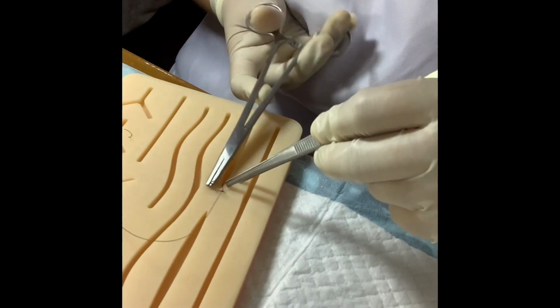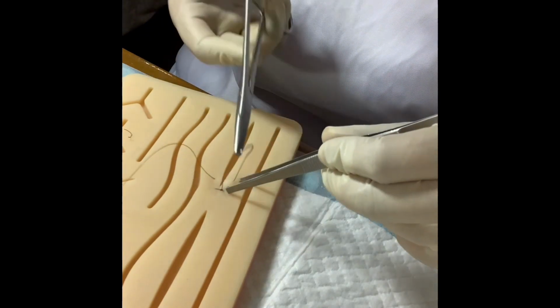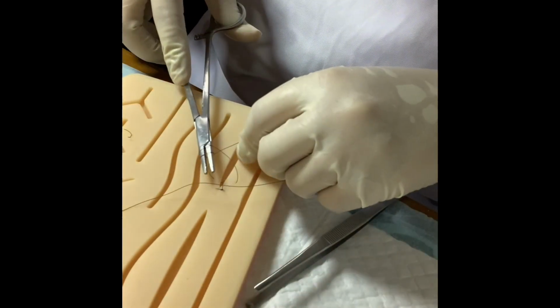Now cut the suture between 5 to 6 mm in length. If it's too short, the knot will come undone. If it's too long, the suture material will become trapped within other knots and they will become undone.